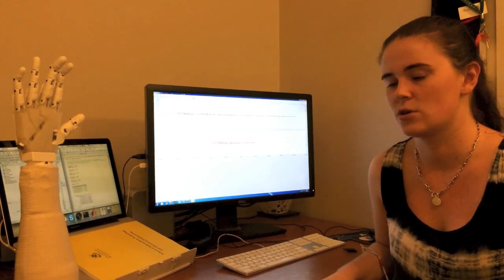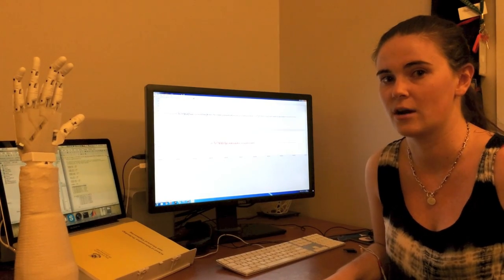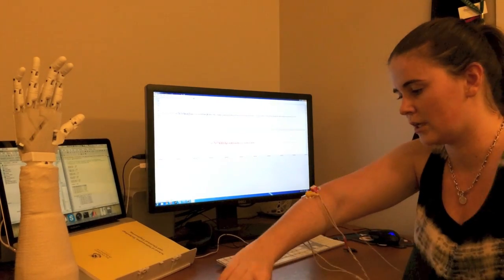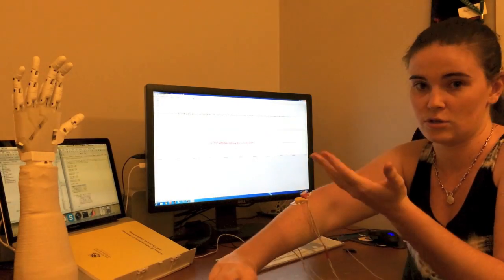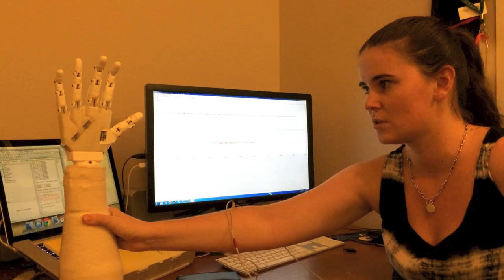For those of you who don't know, my thesis was in controlling a prosthetic arm using surface EMG, which basically means controlling it using the muscles in my own arm and just reading the electricity to use as a control signal. So this is my arm that I built.